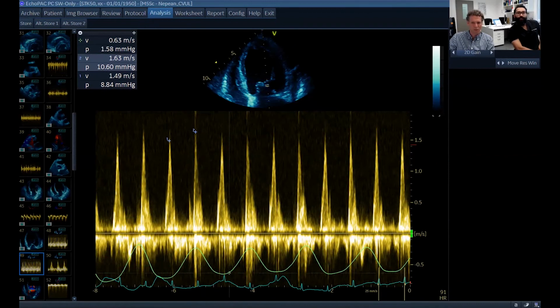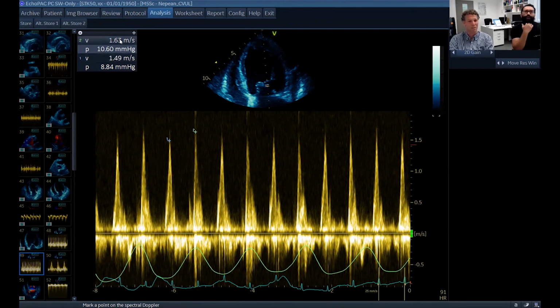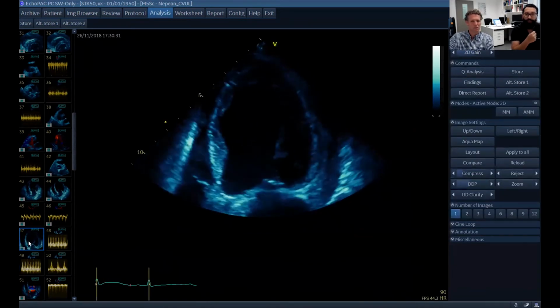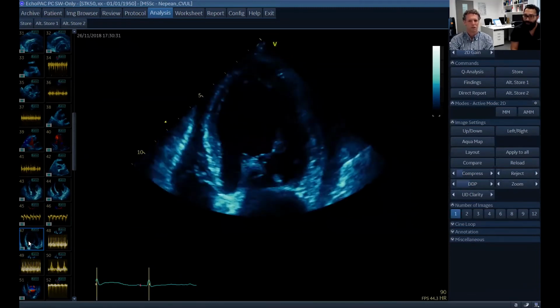I guess this patient's breathing pretty quickly, it looks like here, which again kind of fits with maybe there's some tamponade physiology. And it's not exactly 25%, is it? No. One of the confounding features, and if we can bring up the view here, is we've got a dysfunctional LV. So a lot of these signs are obviously described in people with a good-sized LV.